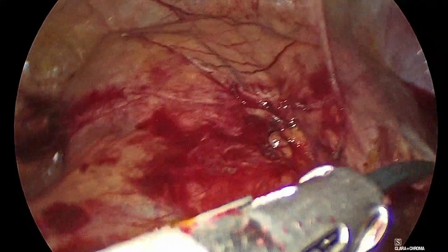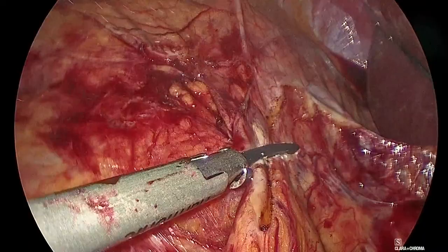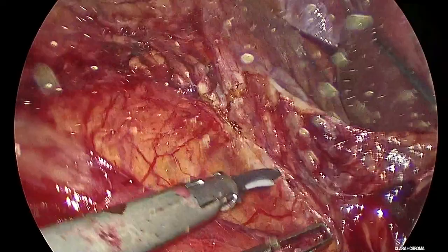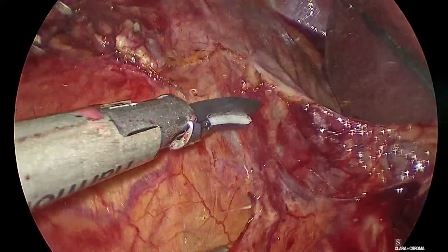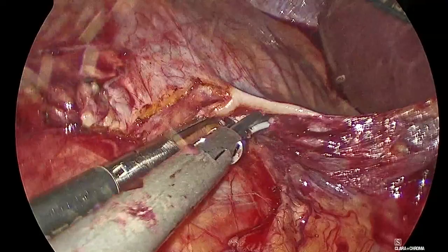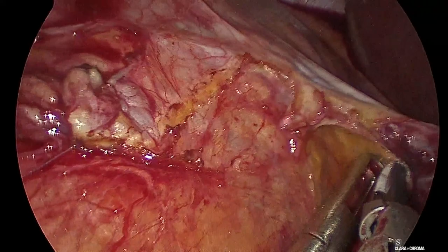And now all we need to do is to go in little by little and dissect all the planes, as you all know. So because this is a nephroureterectomy, we will look carefully for the adrenal gland, and we will save the adrenal gland, of course. So it's important to look for the plane between the kidney and the adrenal gland. See, the adrenal gland was somewhere in there. There's an artery here.